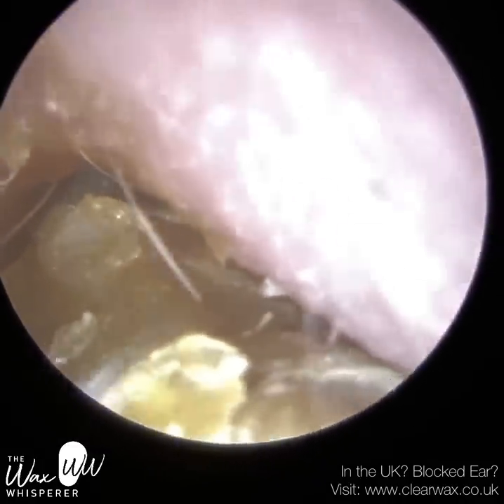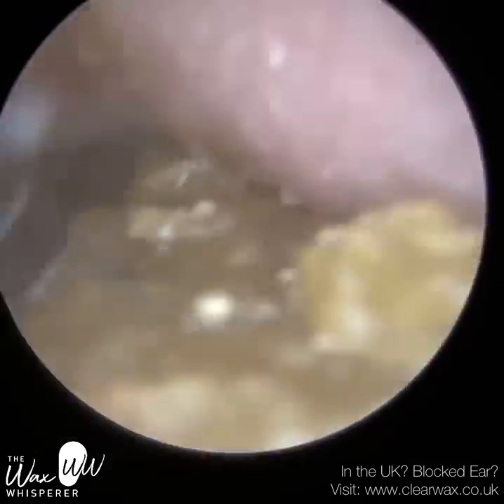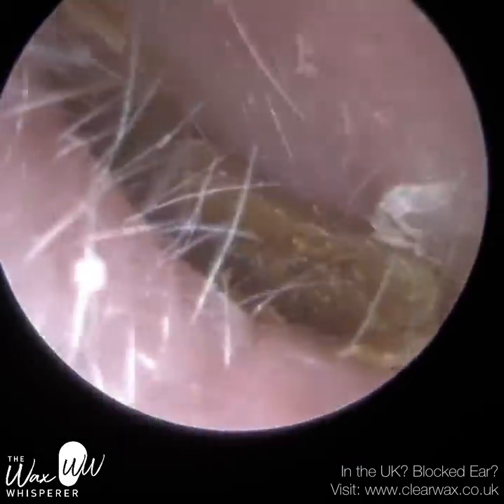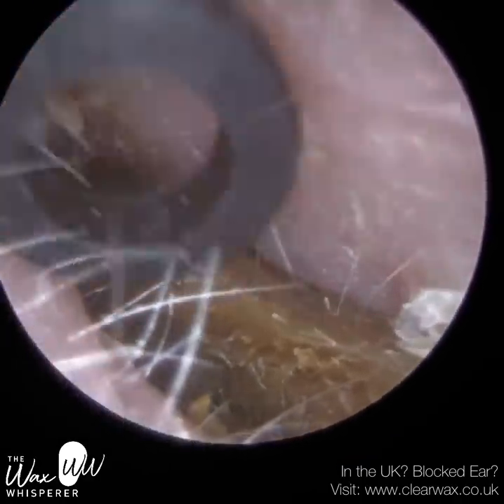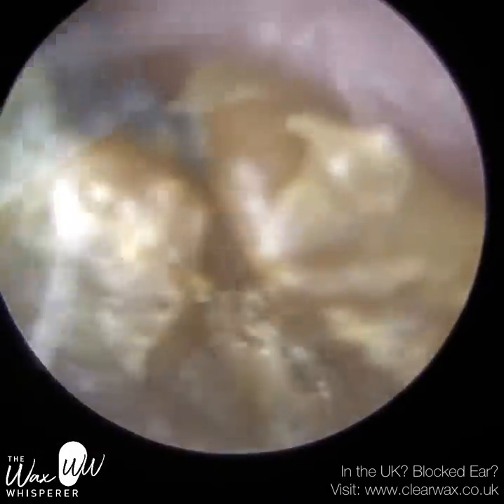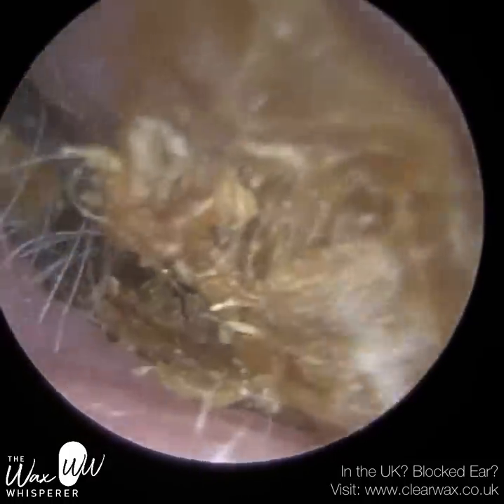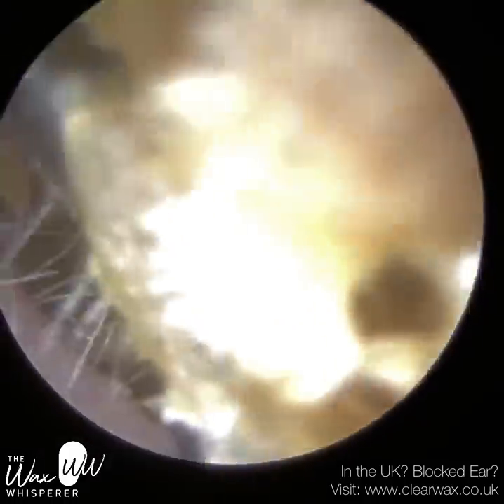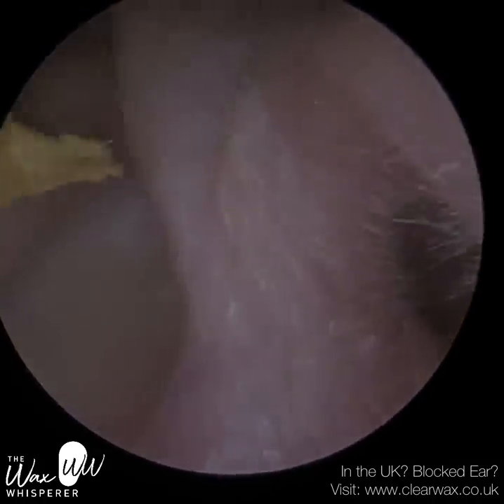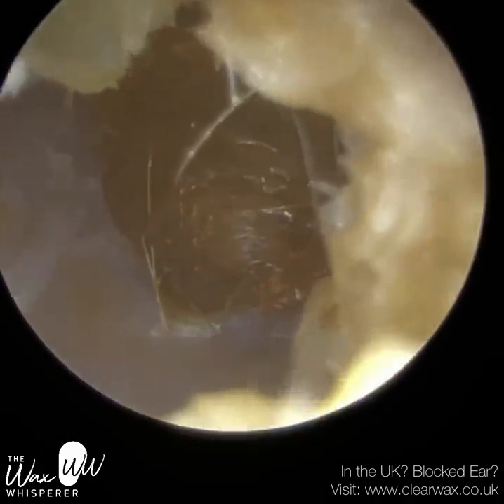What we've done is attach the eyepiece of the endoscope to the camera lens of a smartphone. I'm currently using an iPhone SE. Previously I was using an iPod touch — they were pretty good because they were small, lightweight, and affordable. We want to make it accessible to all the specialists on our training courses. The iPhone SE is probably the most affordable Apple smartphone at the moment, and the camera is really, really good, though it's slightly more heavy and bulky.